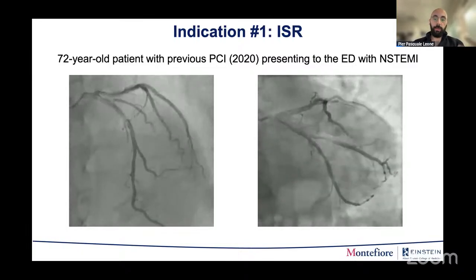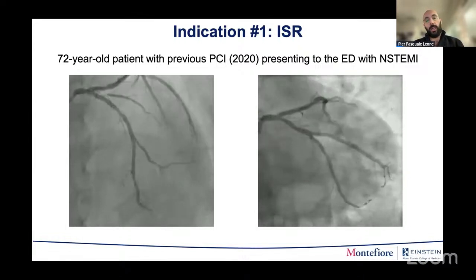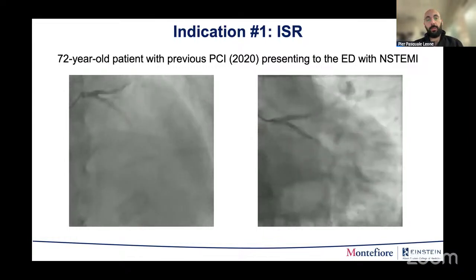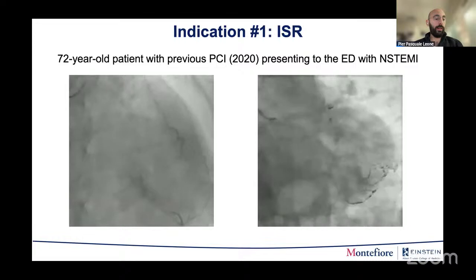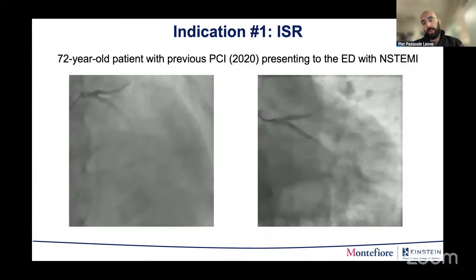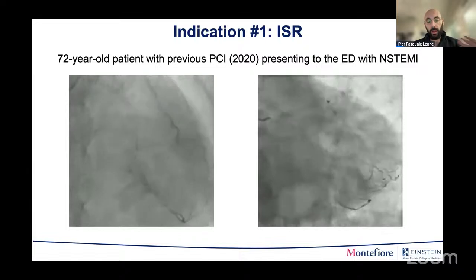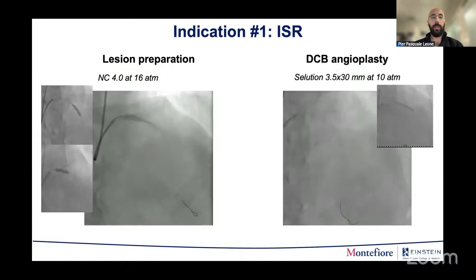I know that also now, since there's been a meta-analysis, the DAEDALUS study a few years back, and this has been accounted for in the latest guidelines in Europe. Now, class 1 for drug-eluting stent ISR is the drug-eluting stent repeat PCI. But I think in this case, it's pretty reasonable to think about a stentless procedure and see how new delivery of drug via drug-coated balloon can really be helpful.